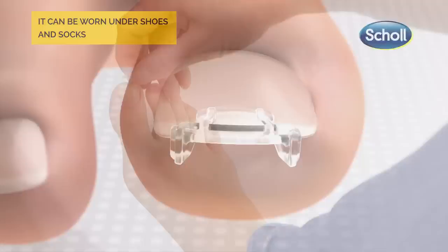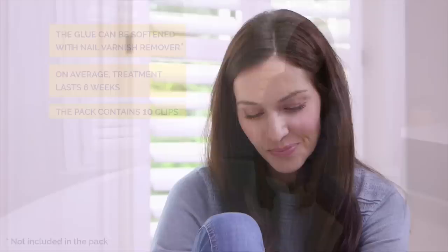Change the clip each week, gently removing it after softening the glue. After 6 weeks, the nail should have grown out sufficiently to relieve the affected area, so your patient can enjoy being on their feet.